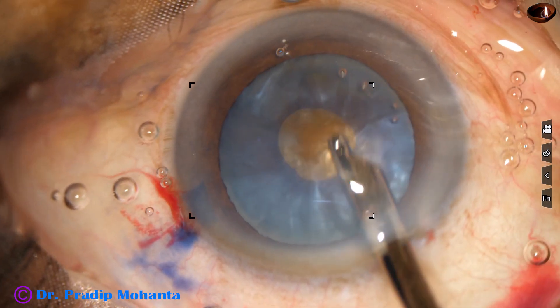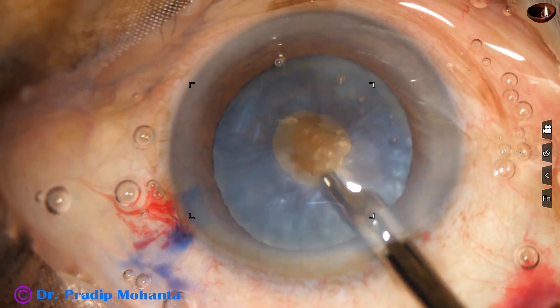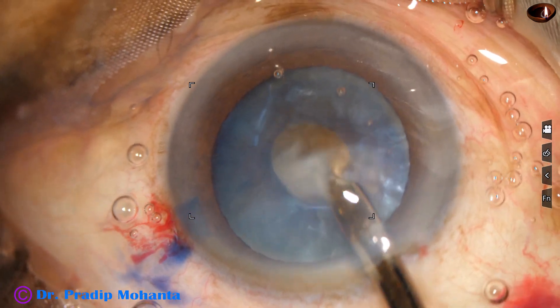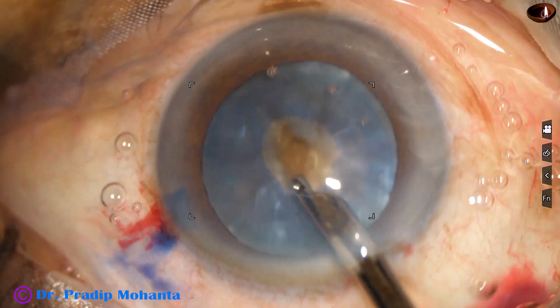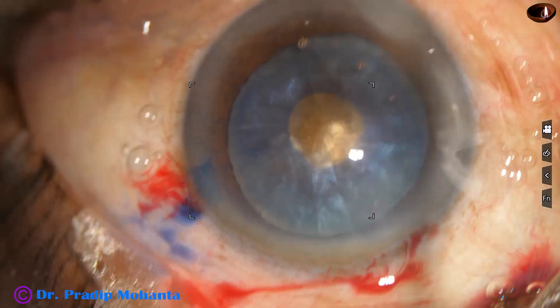As I aspirate the white lens matter, we find this hard brown nucleus. Yes, this is a really very hard nucleus. We will see in a short time how hard it is.